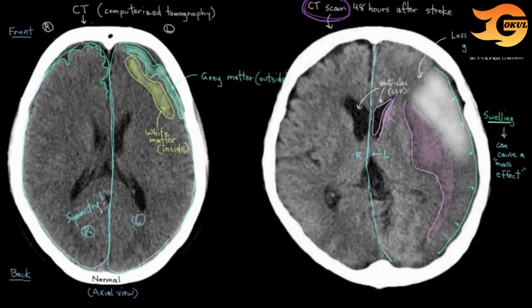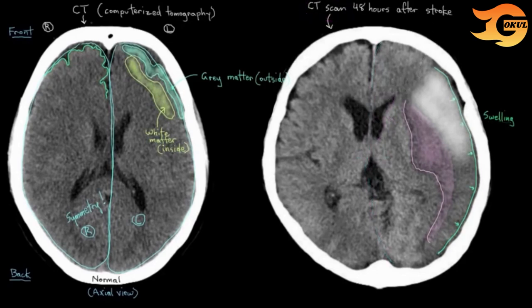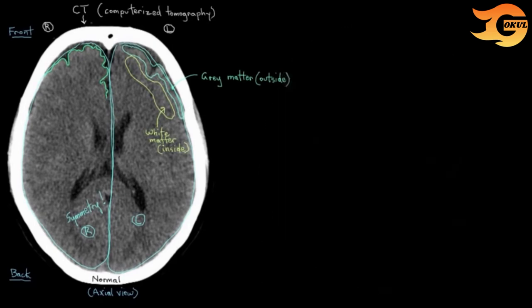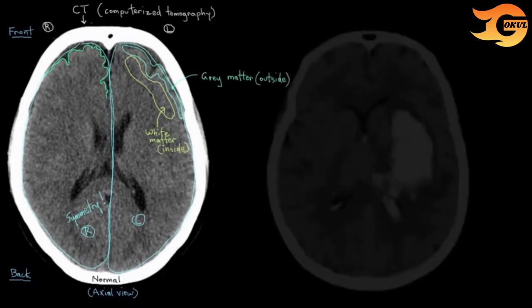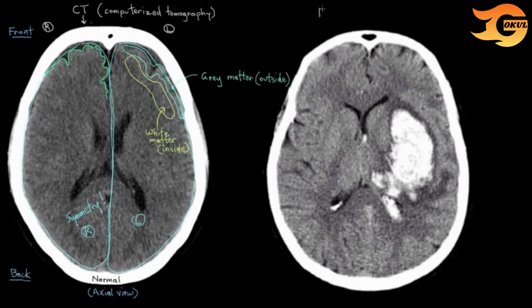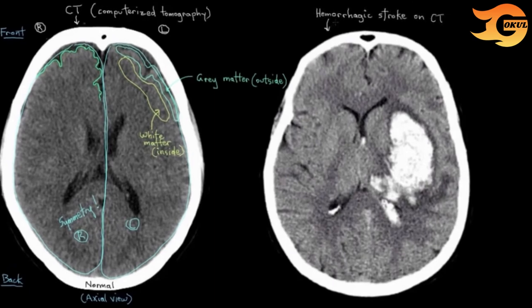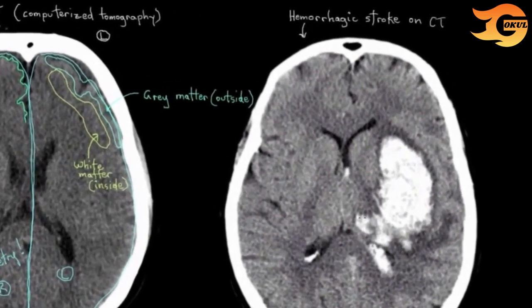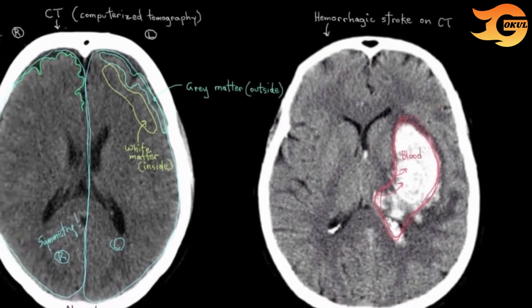Those images were of the most common type of stroke — ischemic stroke. Here's a CT image of the less common type: hemorrhagic stroke. CTs are really good for diagnosing hemorrhagic strokes because blood leaking out of your cerebral circulation and into your head space shows up really well on CT as an abnormal bright area. So that's blood there.